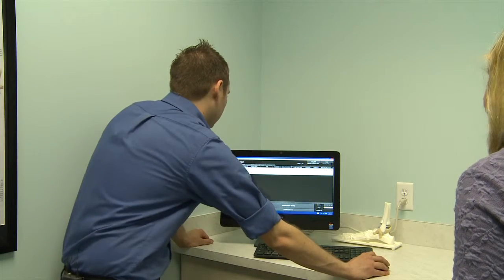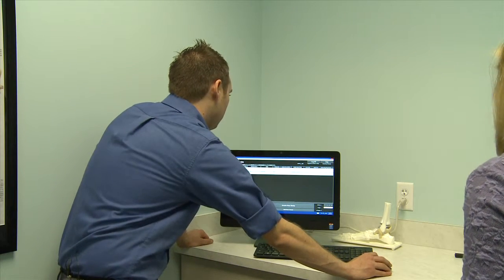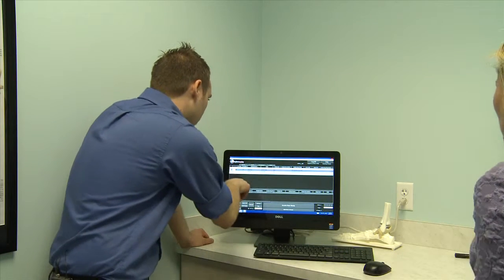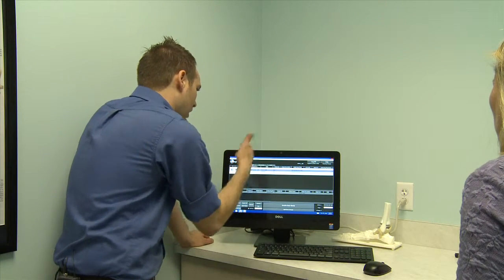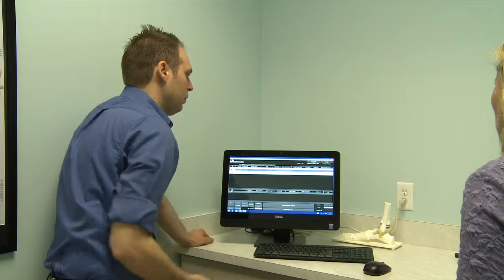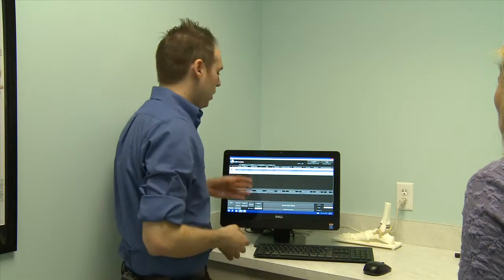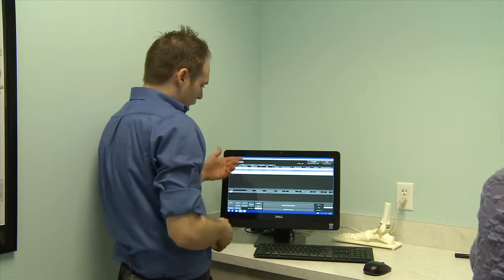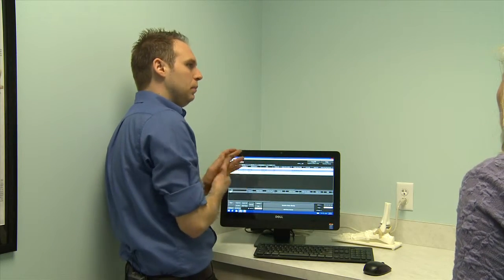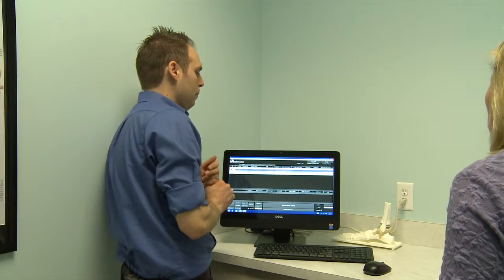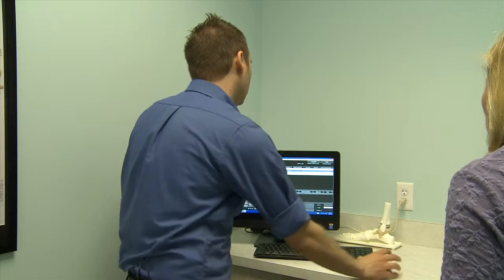Now we have two studies listed. Down here is the previous study — if, say, a study was done a week ago, the system gives you the ability to compare two studies side by side, which you can do in a viewing room.